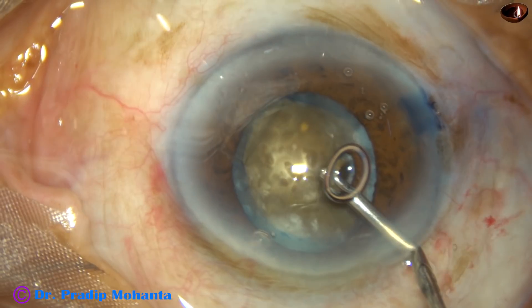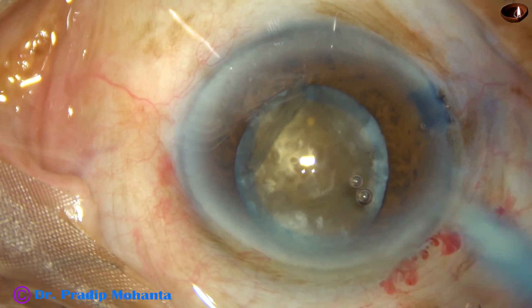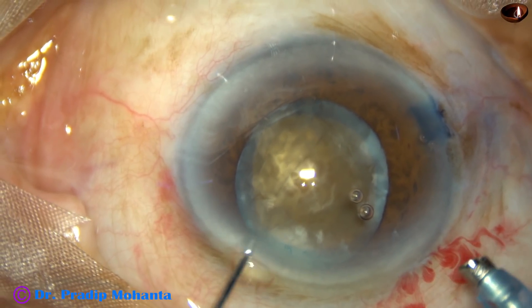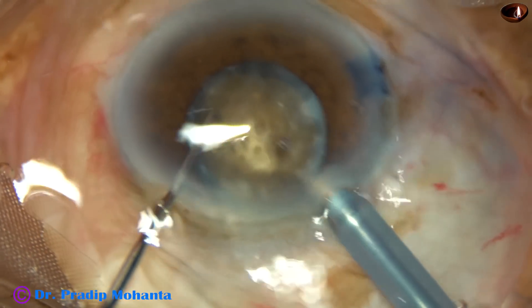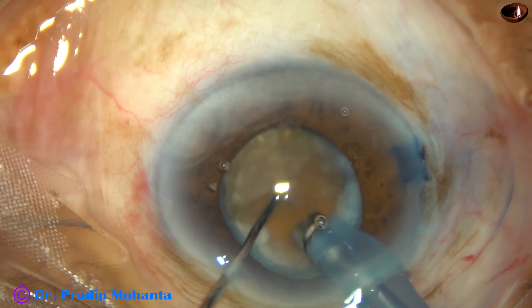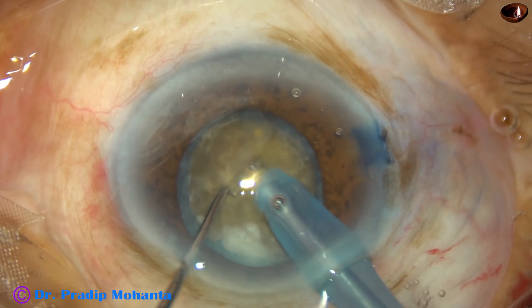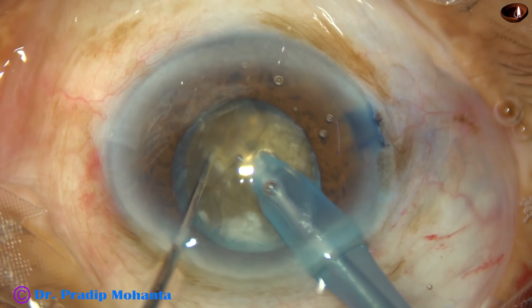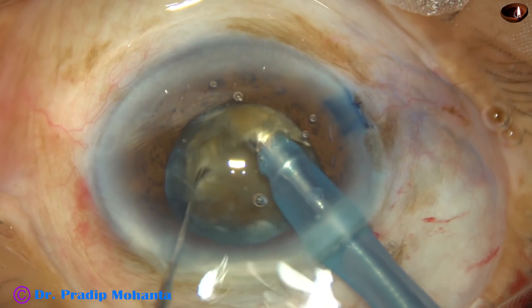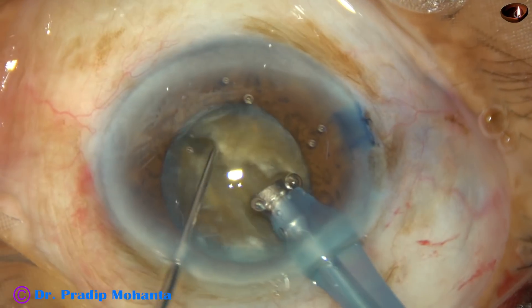Some more viscoelastic to protect the corneal endothelium — this is 2% hydroxypropyl methylcellulose. Now the tip of the phaco handpiece is being introduced into the anterior chamber. As usual, I will try to do a direct chop in this case. The tip is buried into the substance of the nucleus, goes through towards the opposite equator, crosses the central area, and goes towards the opposite equator again. In this case, I had to exert a real force — opposing forces — to crack this very hard nucleus.